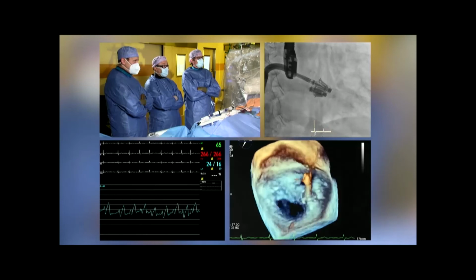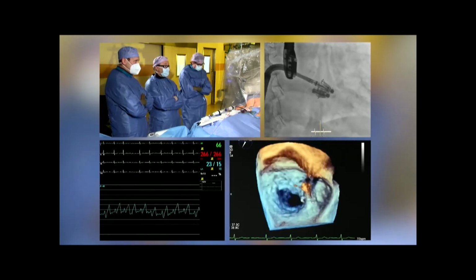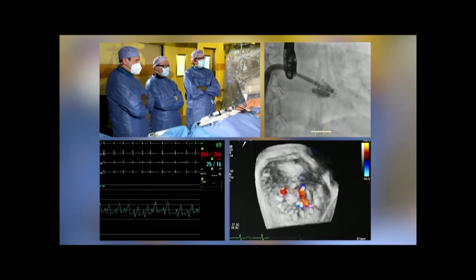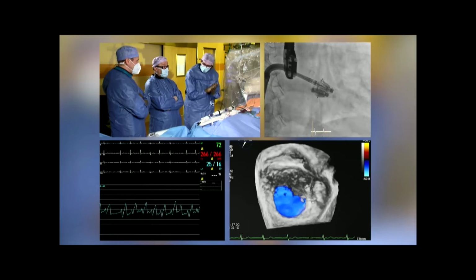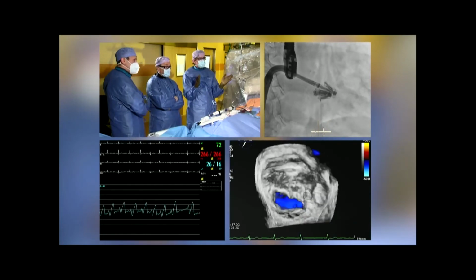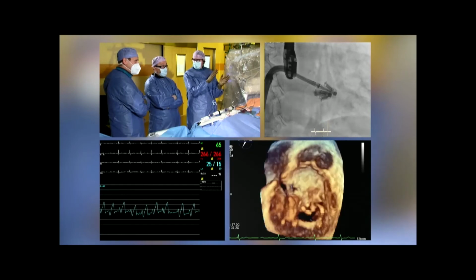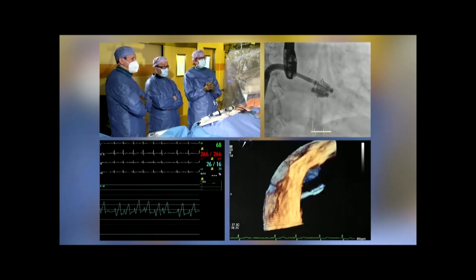You see nicely the tissue bridge, how the leaflets are well in the device. And I think it would be very nice if you can now add the color flow to this view, because we saw it before and now it's significantly better. That's all. I mean, MR assessment is important because we treat MR. But stability, longevity of the result, therefore I believe it's also very important to assess anatomy and the overall appearance of our therapy and intervention.